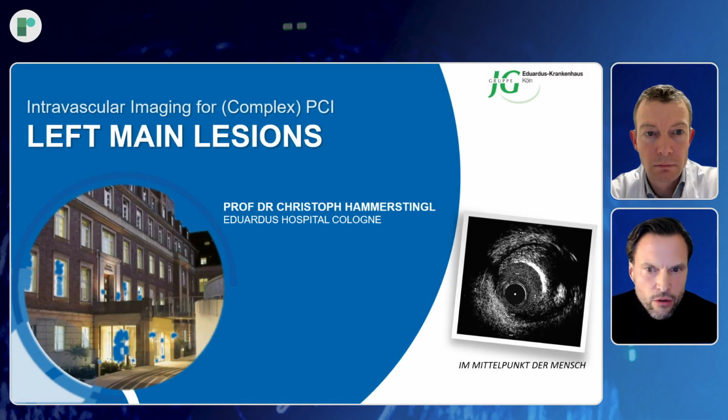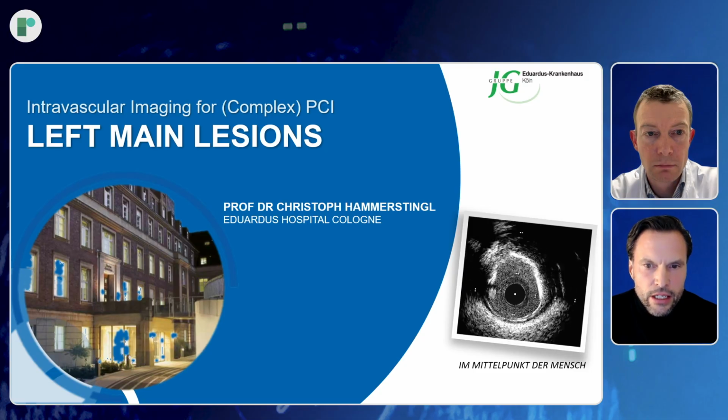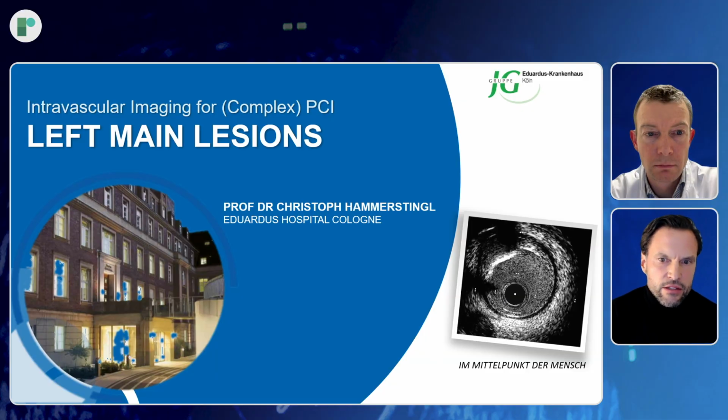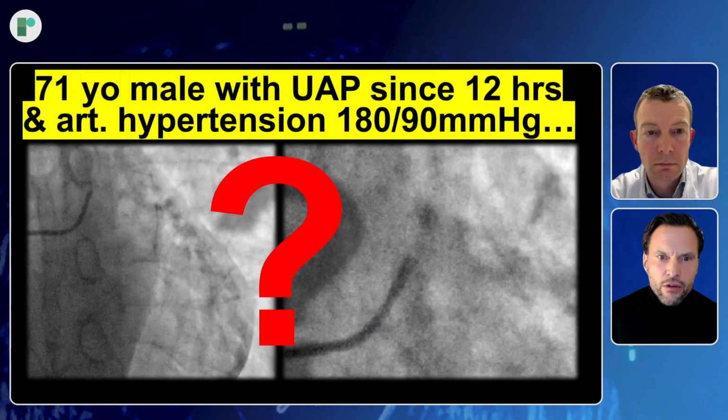So we just go maybe briefly through the cases, and then we can discuss it. Or if you have any comments, please feel free to give your comments about this case.